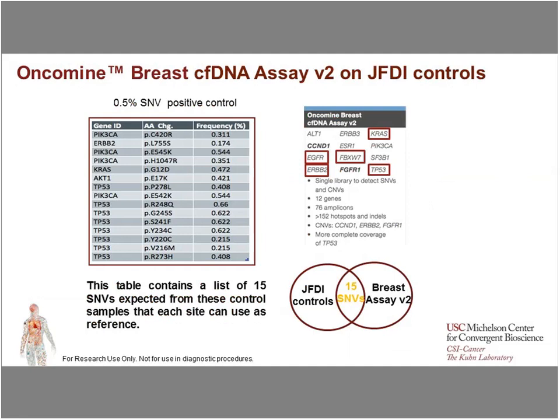So to evaluate the accuracy and the reliability before we implemented this workflow into our HD-SCA platform, we used 4 reference DNA control materials. We tested them before we merged these platforms together.